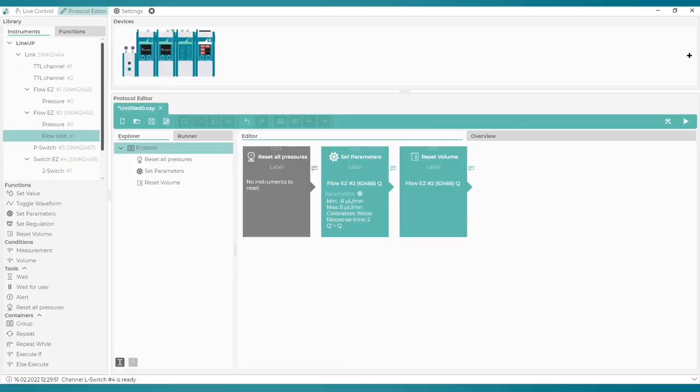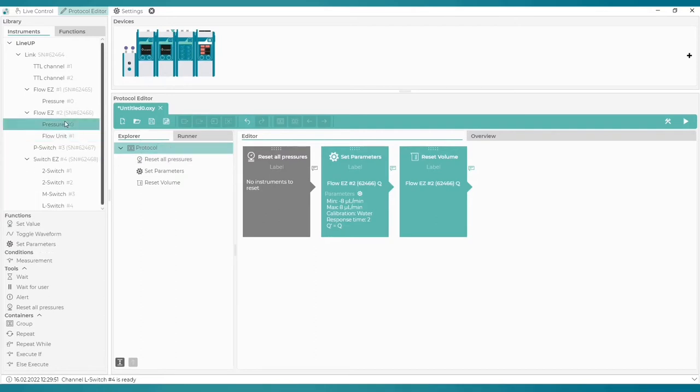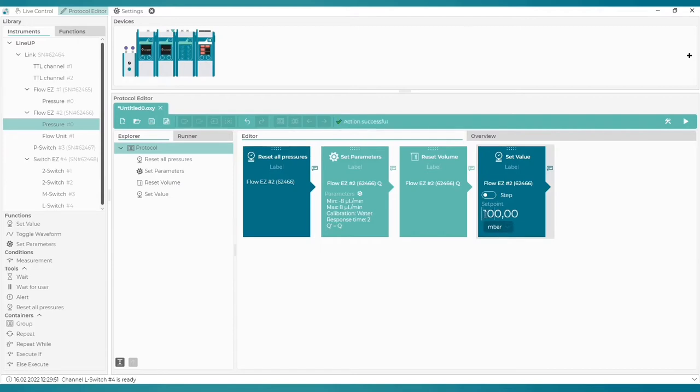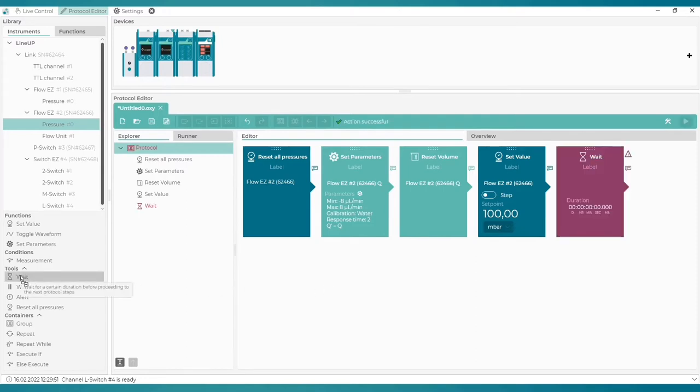We can now set the initial pressure. From the pressure option available for the second flow easy, we select the function Set value and type in the initial pressure of 100 millibar. Next we want this specific pressure to be maintained for five seconds. So we add the wait tool.